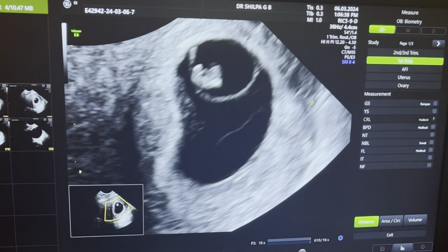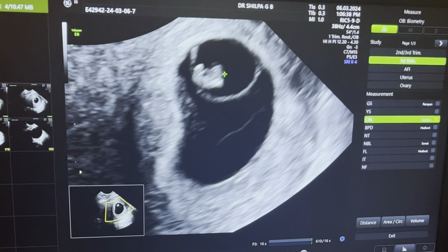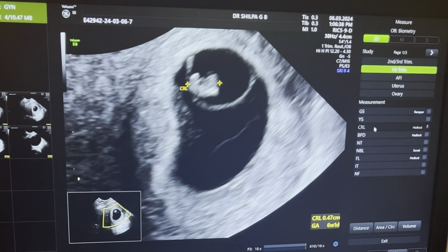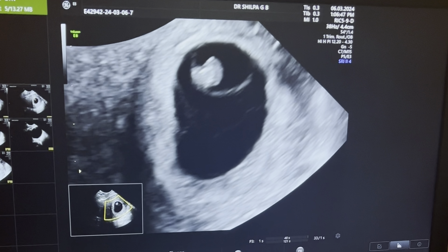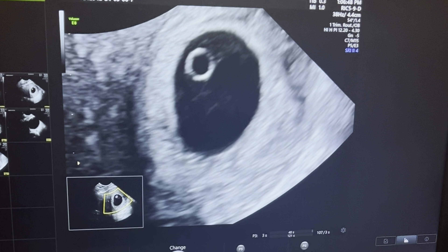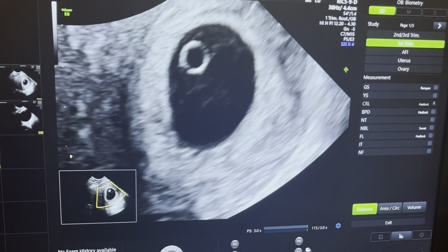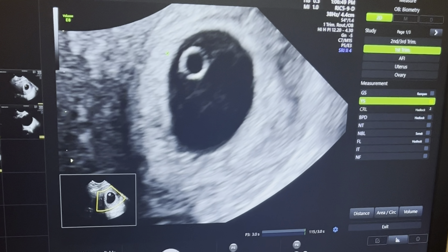We'll have to start taking measurements. First I'll take the CRL. The CRL is corresponding to six weeks and three days, whereas by her last menstrual period she is eight weeks and five days.